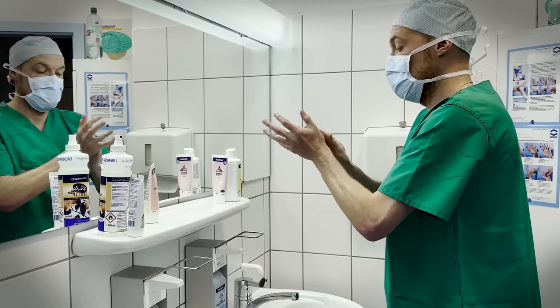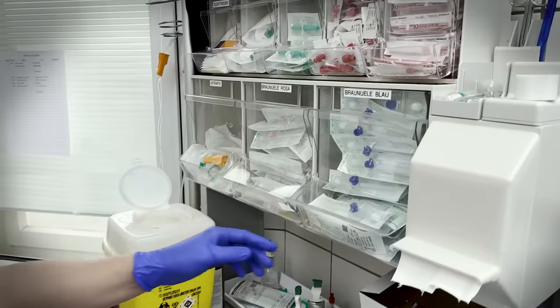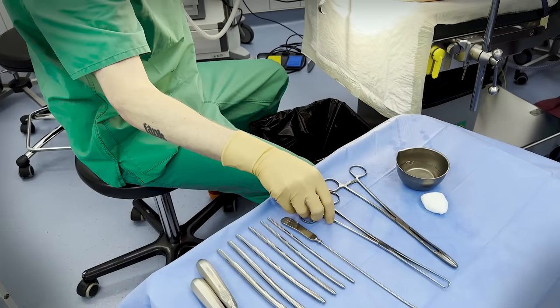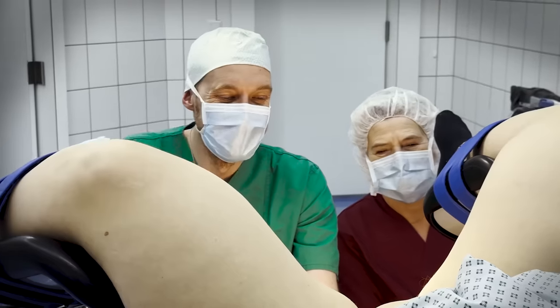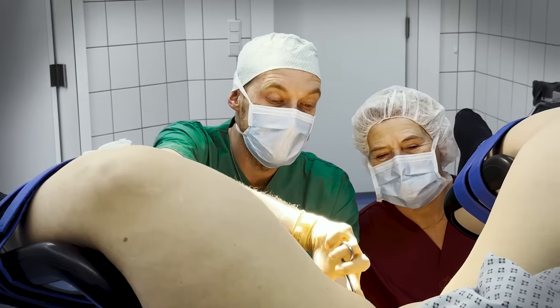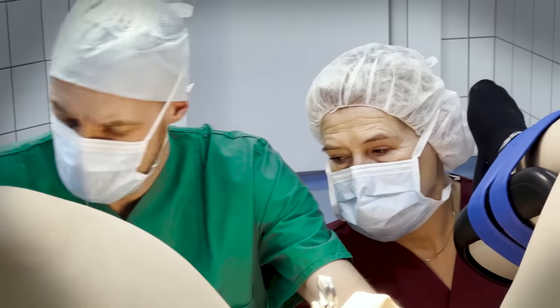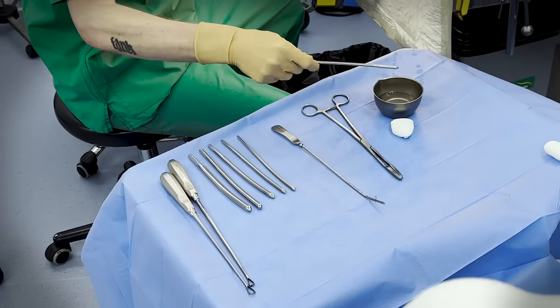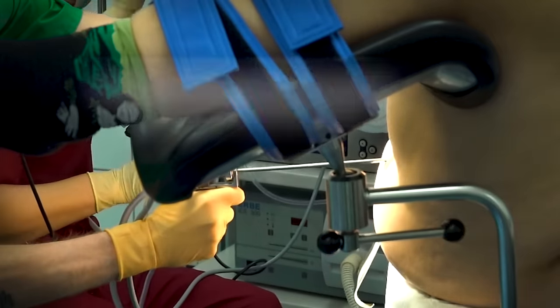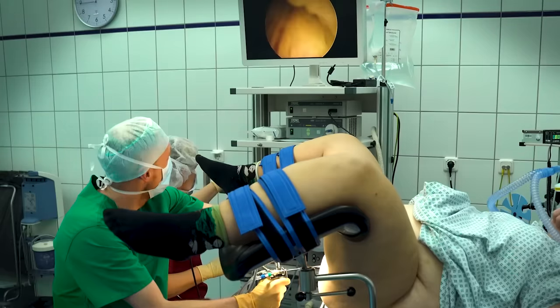As with any operation, hands are first disinfected and sterile gloves are put on. The anesthesiologist then performs anesthesia. The first step, as I said, is to determine how long the uterus and the uterine cavity itself are. For this we use small Hegar dilators to open the cervix and then look — with the camera, of course — at what the uterine cavity looks like from the inside.